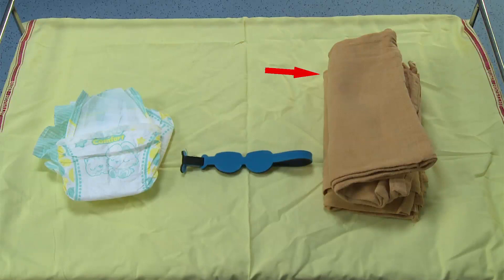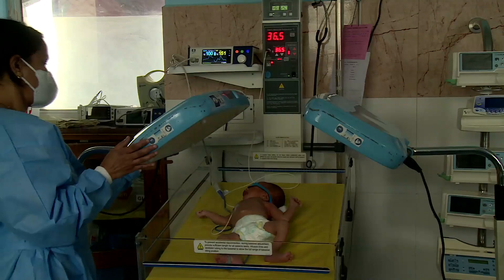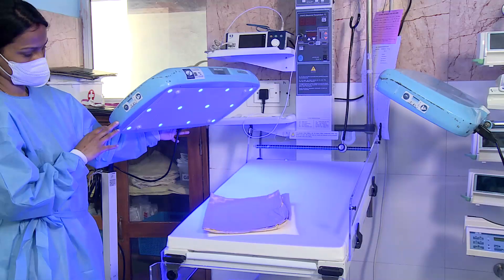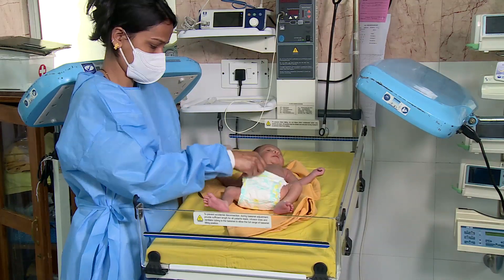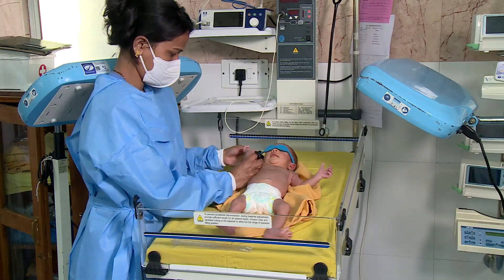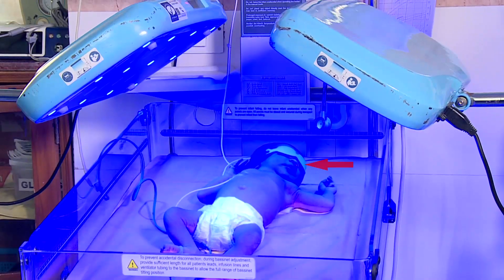Wash your hands, put on the phototherapy unit, and check that all the lights are working. Then follow the setting parameters as per the manufacturer's instructions. Do not put anything above the phototherapy unit. Expose the whole body except the eye and the genital area, and keep the baby as close to the phototherapy unit as per manufacturer's instructions.